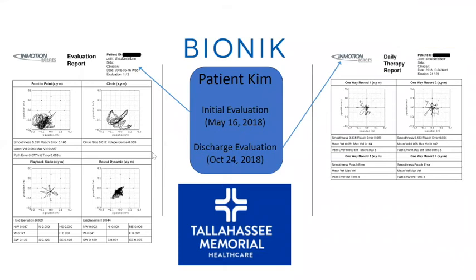Absolutely. One of the nice things you see here is how even in a patient who only has movement in one quadrant, they can still utilize the device. In her case, you'll notice that the weakness and the synergy pattern is affecting her ability to even get to the center point.